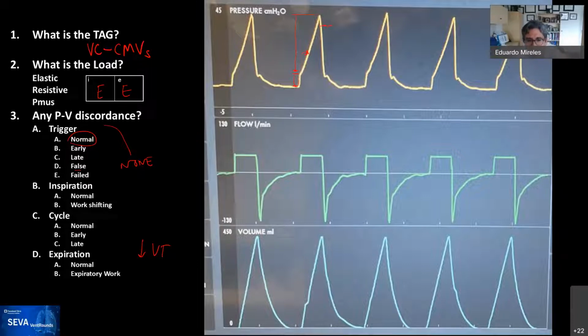We have some cases, and actually I don't have one here, in which just by changing the flow rate and the settings, you can change the calculated stress index that is coming from the machine, which would be concerning. However, if you set the flow rate low enough, and long enough to see the behavior of the curve, I think that could be appropriate, Miguel, as they did in that article. I'll put the reference later on here when we're done with this.